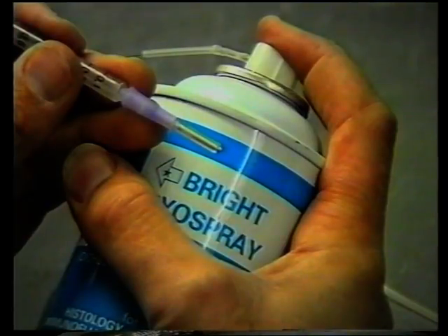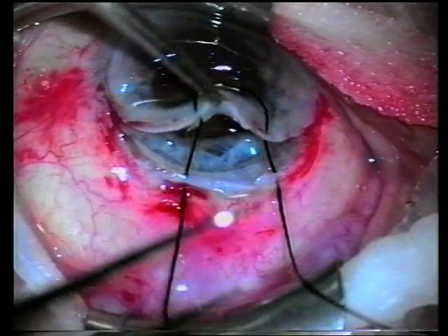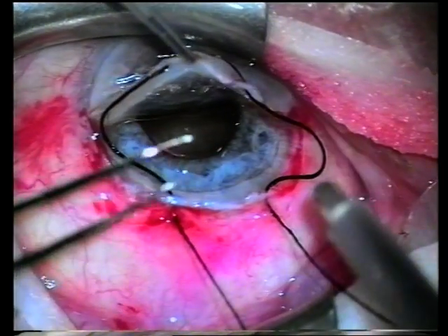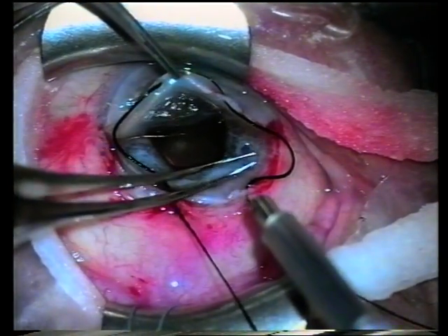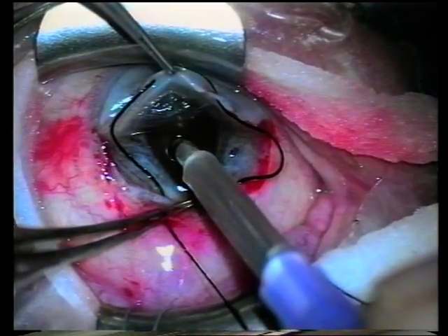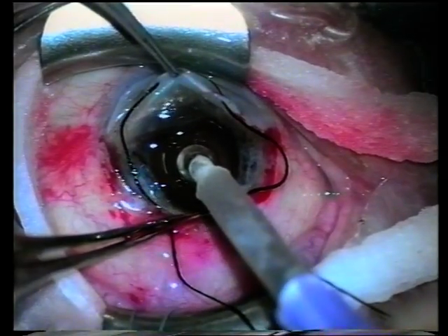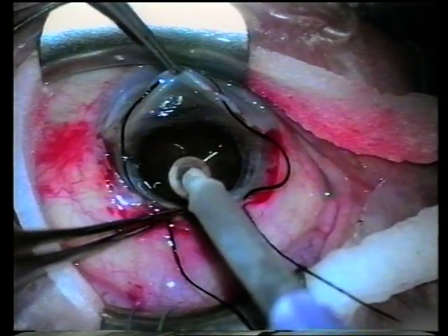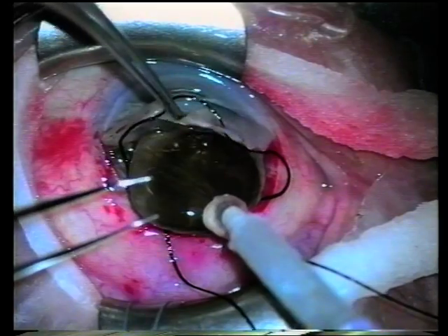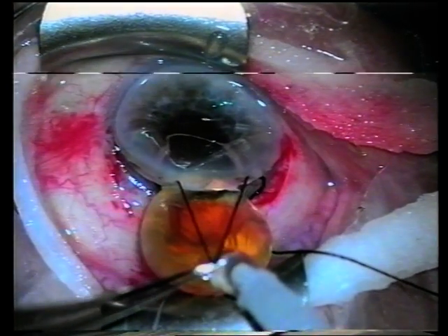The cooling is done with the cryo spray — any other Freon spray would do. After a good incision is made in this eye with a standard cataract approach, we are showing how effectively a lens can be extracted with this procedure. Retract the iris quite a lot, make sure that you have broad access to the capsule, and freeze deeply. Make sure that the nucleus is frozen with the lens, otherwise one may break the capsule and cause havoc. Slight pulling movements and lifting forward results in total extraction of the lens in this typical intracapsular procedure. The pre-placed sutures are closed and in this manner the patient becomes aphakic.